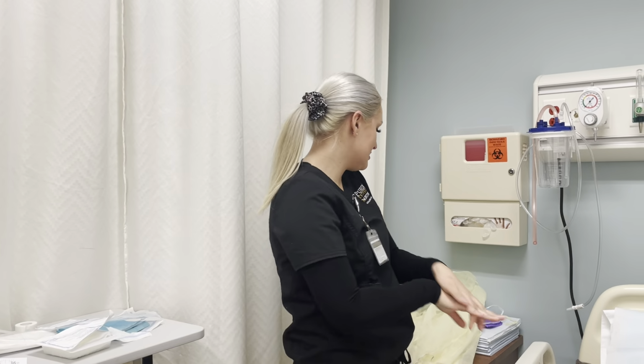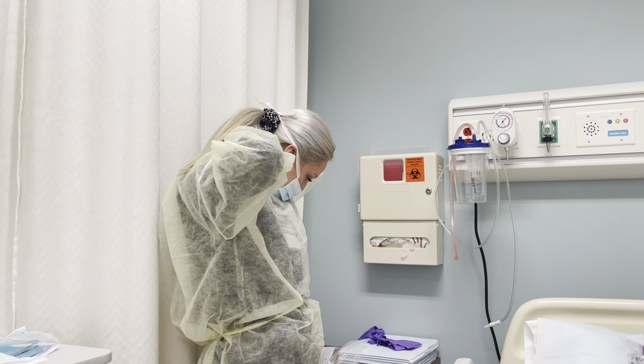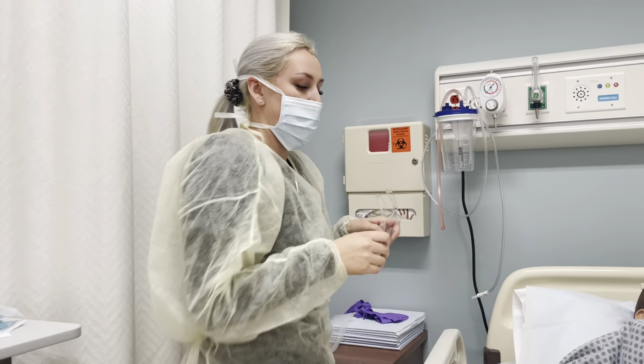Now I'm going to take one gauze pad, and then I'm going to take another gauze pad. I'm going to take my abdominal pad. I'm going to go ahead and do my tape sleeve. Take all the sides down. I'm putting on my goggles.